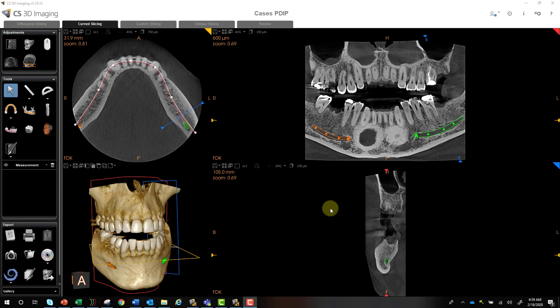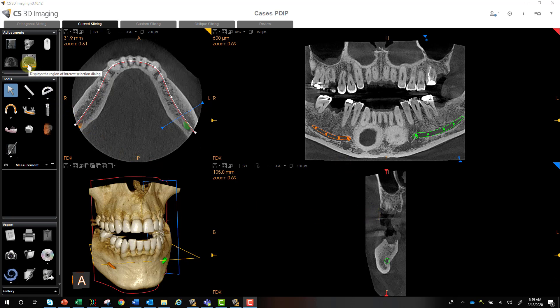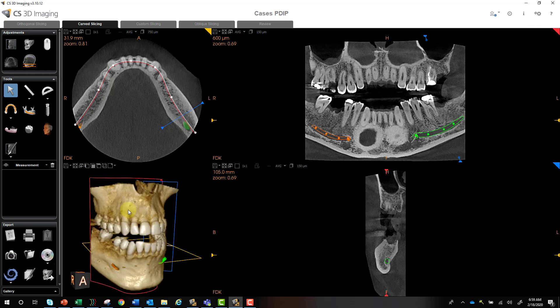Hey, this is Phil, and this is part three of the Implant Planning Tutorial. So in parts one and two, we've already created our panoramic curve, we've mapped our nerve, we've taken measurements in a couple of different ways, we've used the region of interest tool to crop out the maxilla, and a few other things.